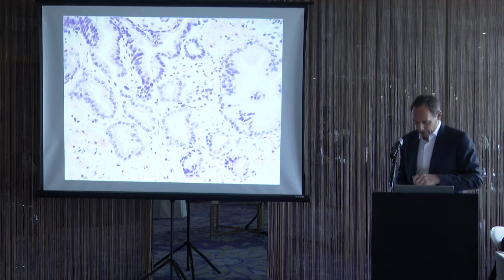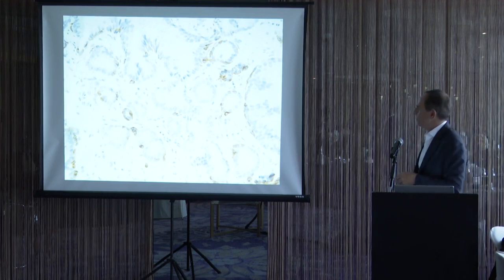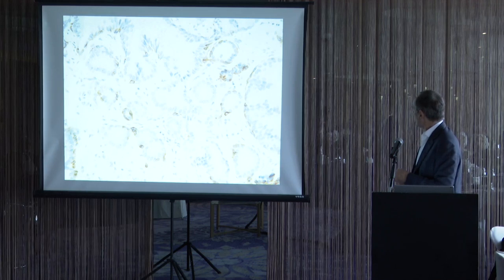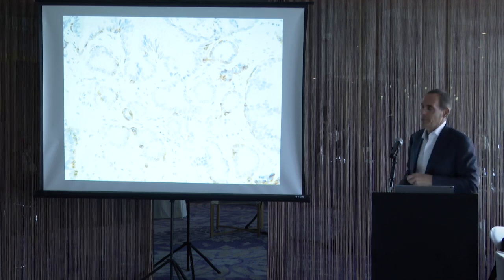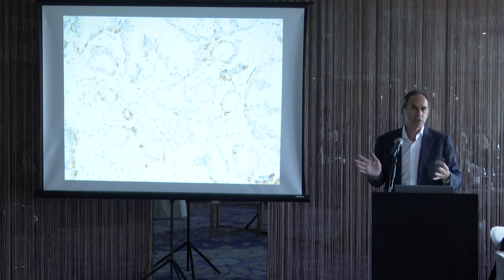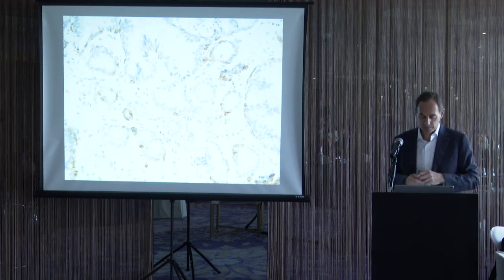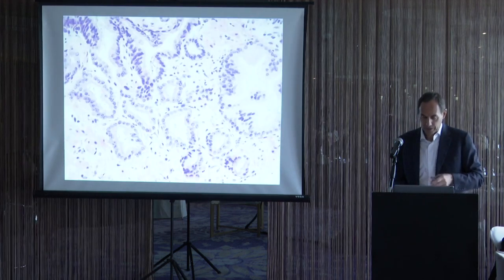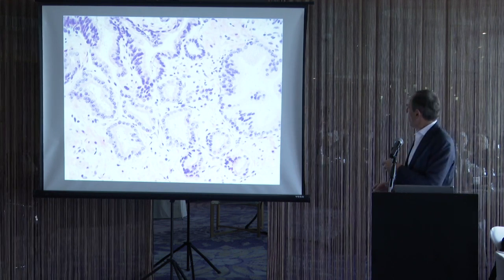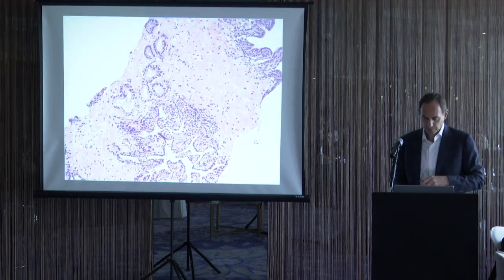Do you have too many small glands that are not potentially an outpouching off a PIN? So what you want to do in this situation is a basal cell stain. When you do a basal cell stain, you can see that many of these small glands are patchy. Now, a few of them are negative, but there are too many here to be patchy. So in this case, this is PIN-ATYP. I would not diagnose this as cancer. I'd say high-grade PIN with adjacent atypical glands. On the H&E, this is highly suspicious for prostate cancer, but again, when you have adjacent high-grade PIN, you have to be cautious and do the basal cell stains.